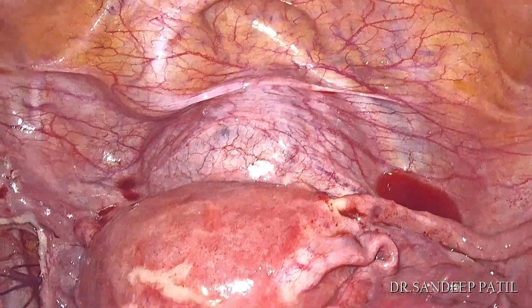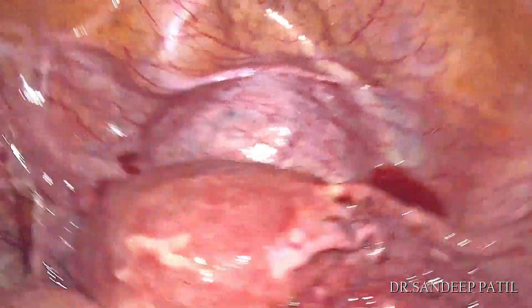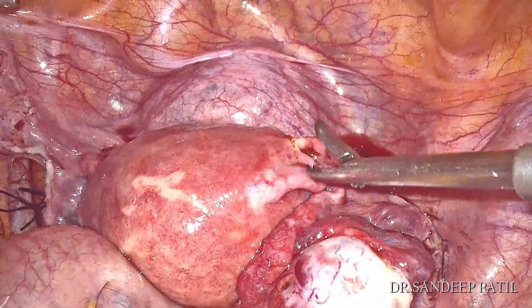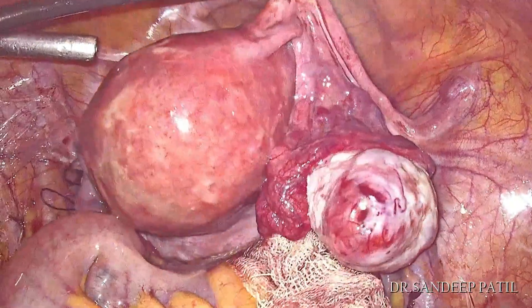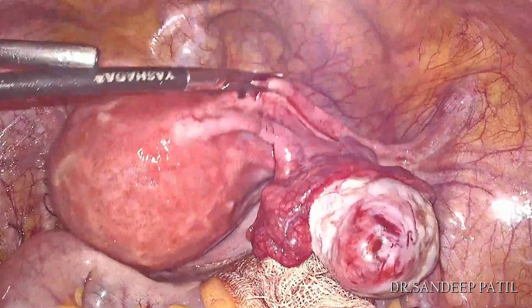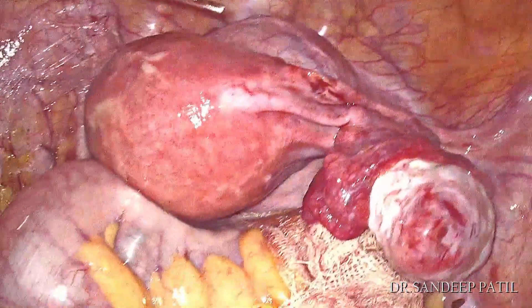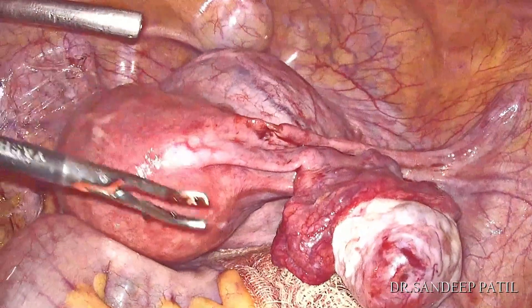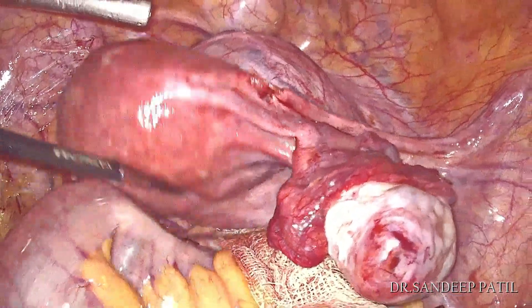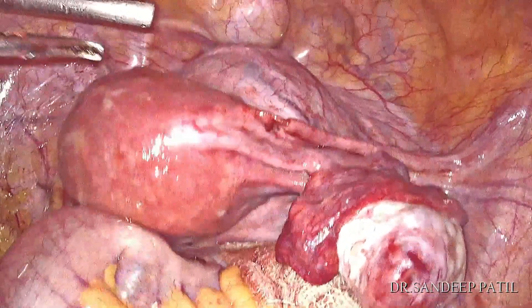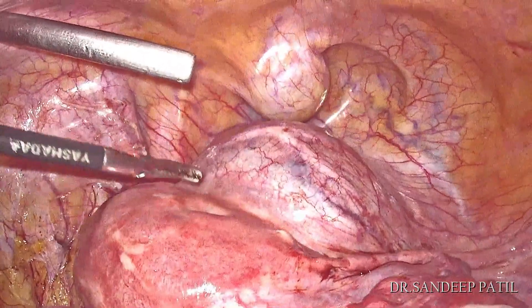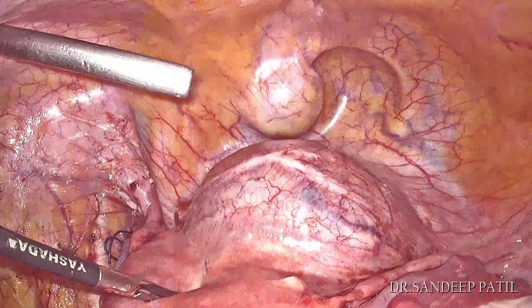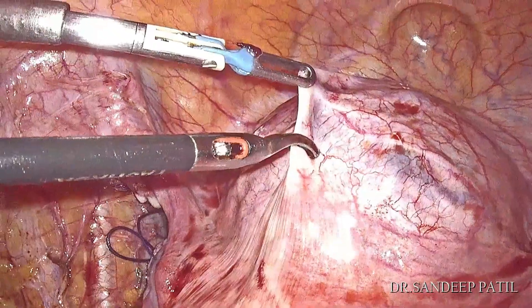Now you can see the cervical fibroids are causing bulge both anteriorly and posteriorly at the level of the cervical region. The normal size uterus can be seen sitting over the fibroids.